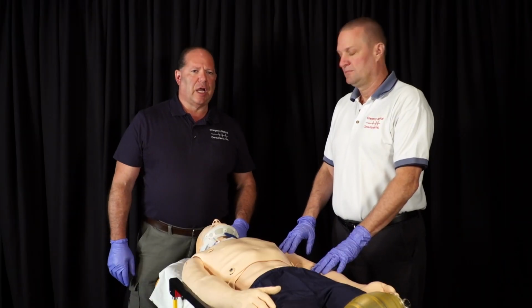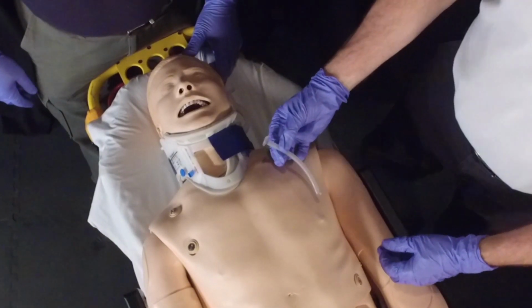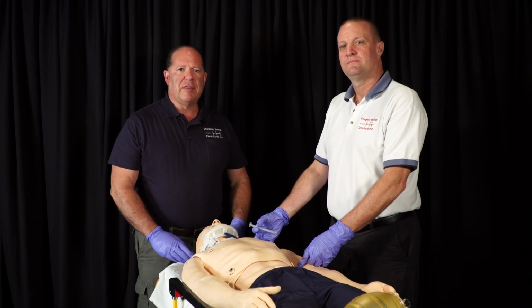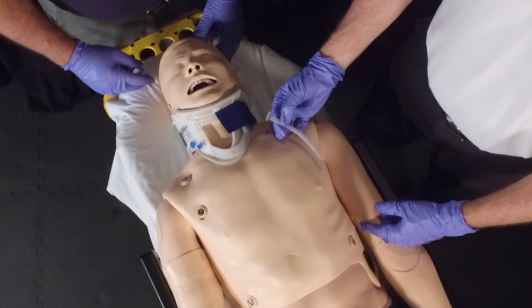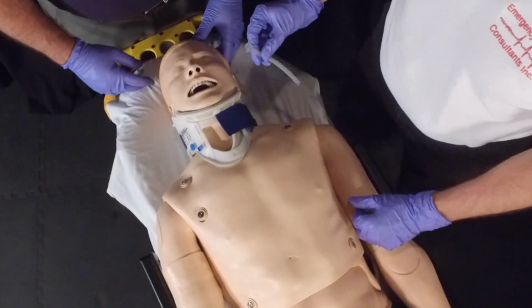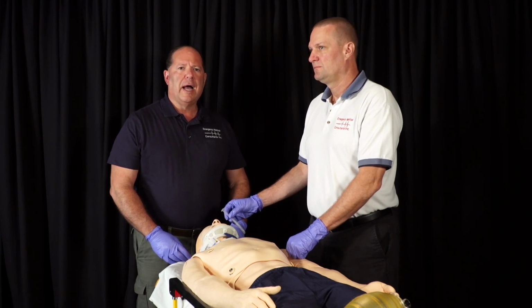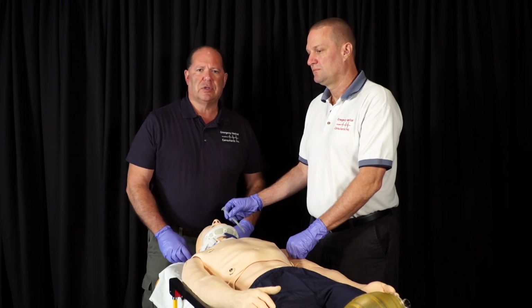The nasopharyngeal airway is used in patients who have a gag reflex who still need airway management based on the fact that they're snoring or gurgling. They're not able to accept an oral airway, like I said, because they either have clenched jaws or have a gag reflex. So this goes through the nose. Remember that we can't use this in patients who have significant front facial trauma or signs of a basal skull fracture, such as bleeding from the ears, CSF from the ears, or a later sign, bruising around the base of the ears, or Battle's sign.